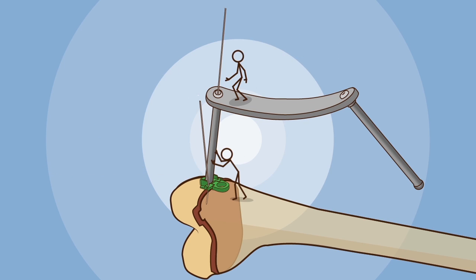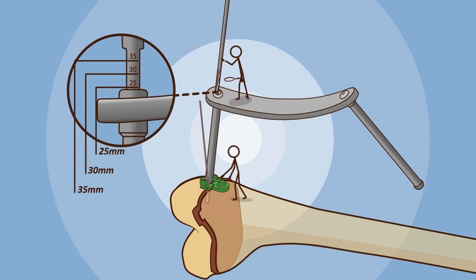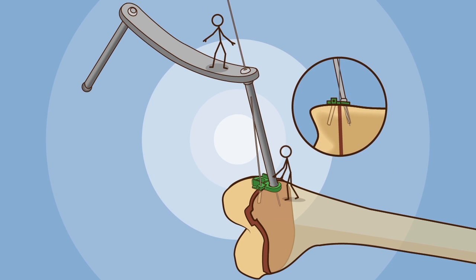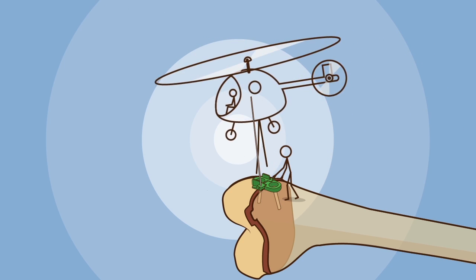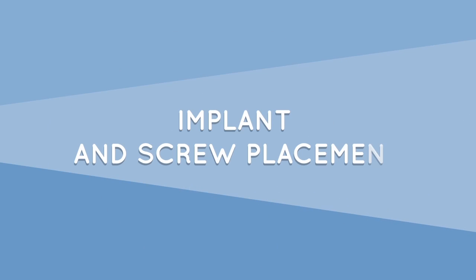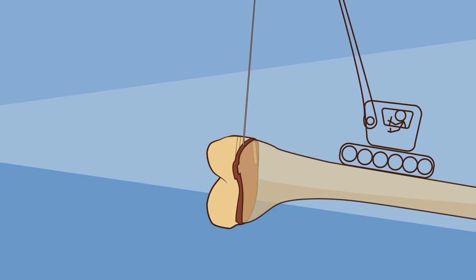Using the cannulated drill bit, prepare a screw hole to the depth indicated by the selected screw length. Once the first hole is drilled, proceed with the same method for the second hole. Having both holes perforated, proceed to remove the template.